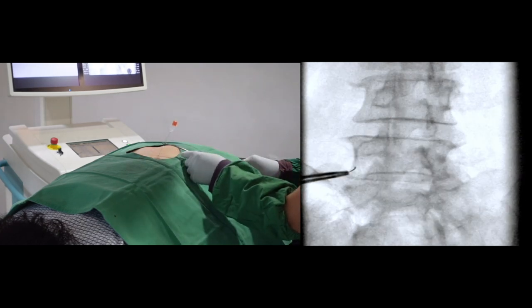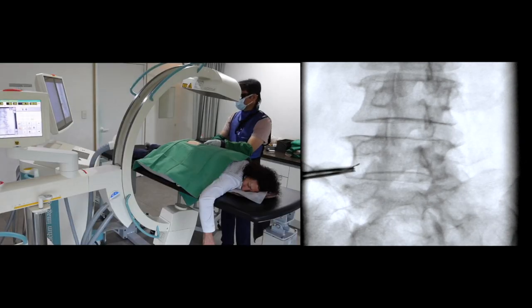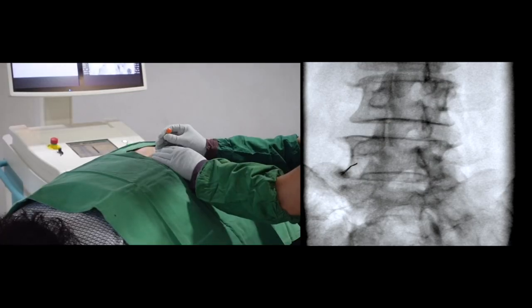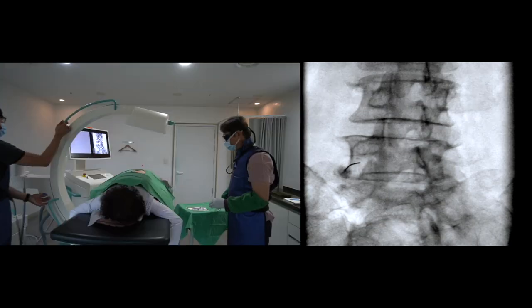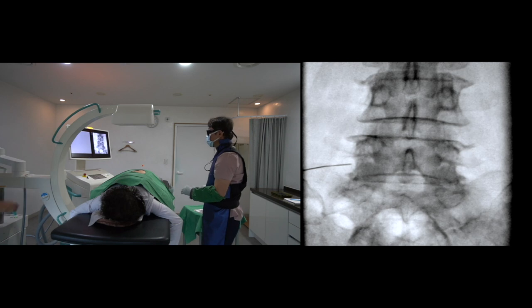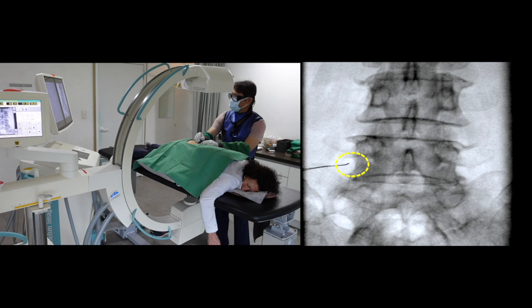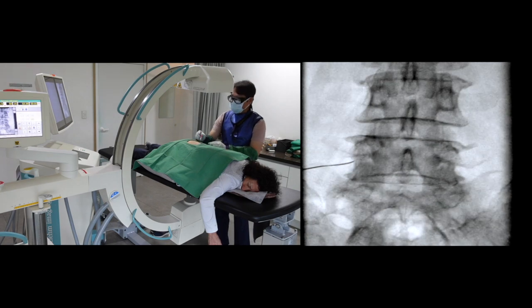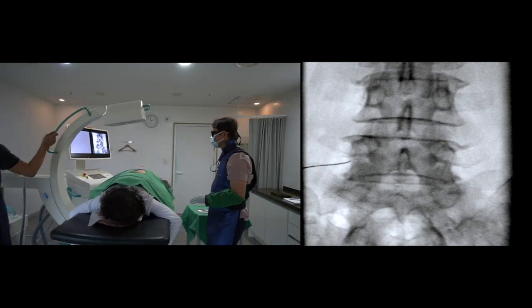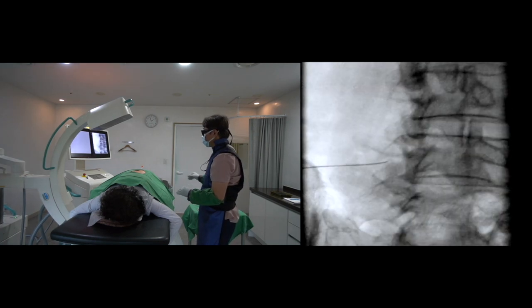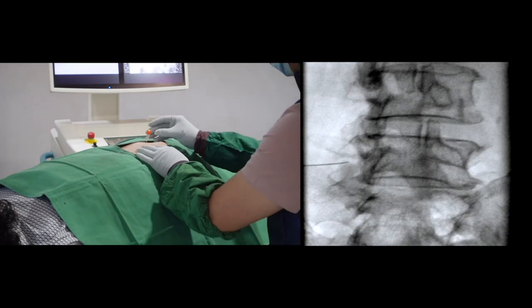The skin puncture site will be more lateral than the standard point, but I try not to go too close to the lateral border of the superior articular process. On AP view, a slight twist of the needle turns its direction toward the target. On the contralateral oblique view, I can see the lateral border of the articular process — I need to pass under this border.